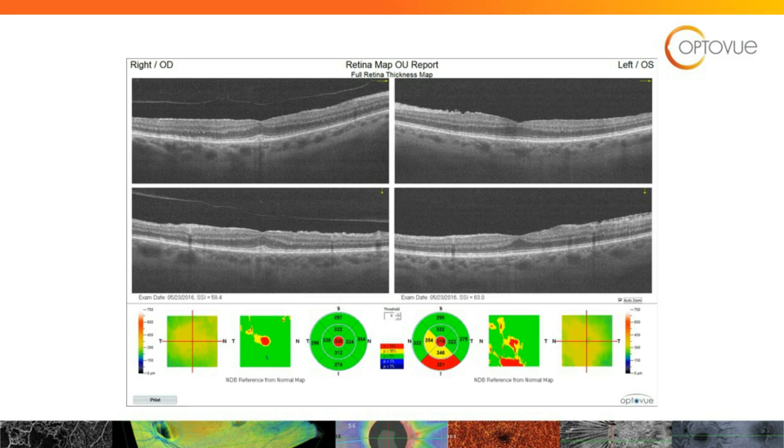And you take a look at the OCT, and this patient has an epiretinal membrane. But I bet we all agree that this epiretinal membrane is not a 20/60 epiretinal membrane, especially in that right eye. I would expect that vision to be 20/30, if not better, in the right eye. But yet it was down, so that's why some further testing was wanted by the retina specialist.